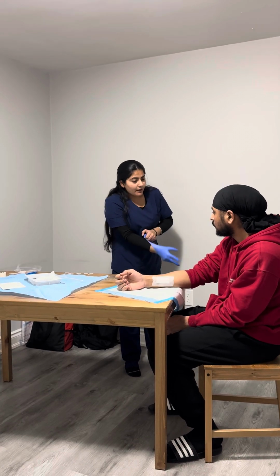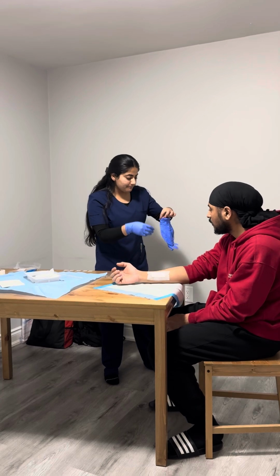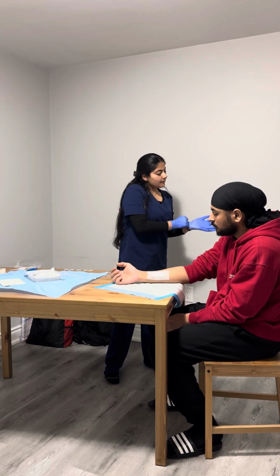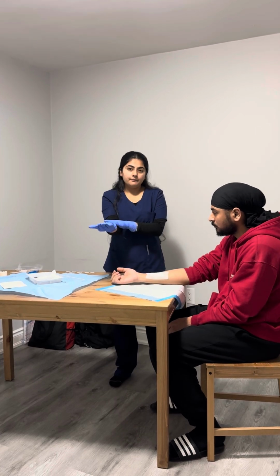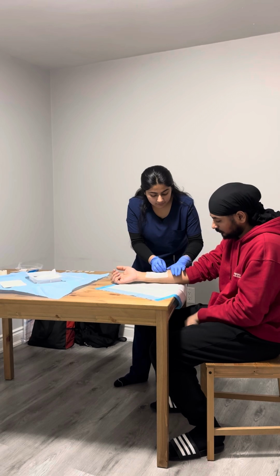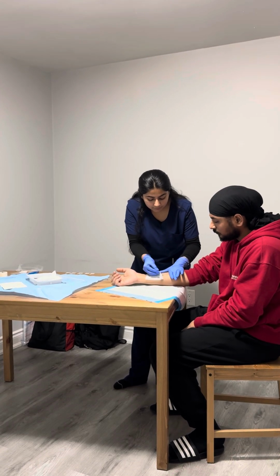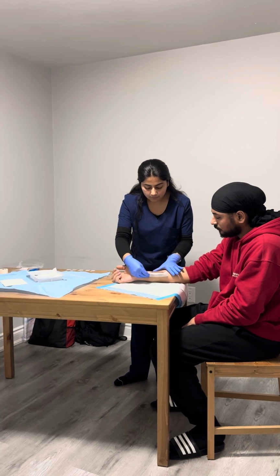Okay, Mr. Smith, while I'm removing the dressing, if you feel any kind of pain, you're going to tell me right away. Yeah? Okay. So, as I can see, the wound of the patient is at the right forearm. So let's just take the dressing off. Okay, so while I'm doing it, if you feel any pain, let me know. I'll remove it very gently so the patient feels comfortable.